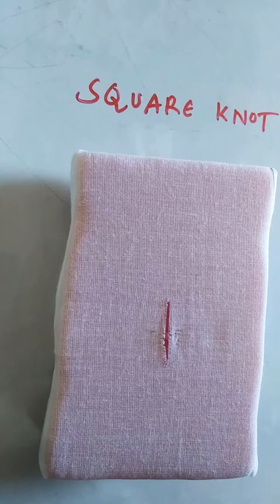In this video, we'll discuss types of suture knot tying. There are three types: square knot, surgeon knot, and granny knot. First, we'll discuss the square knot.